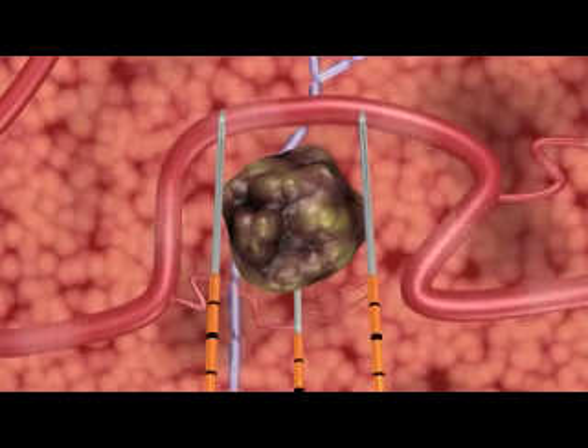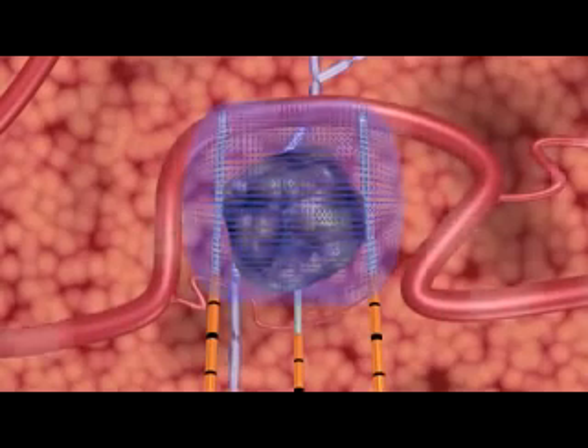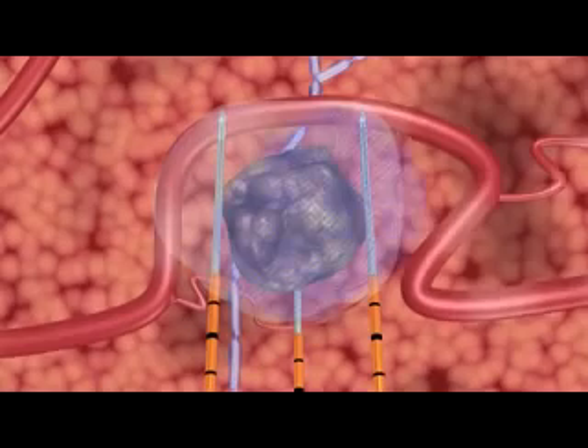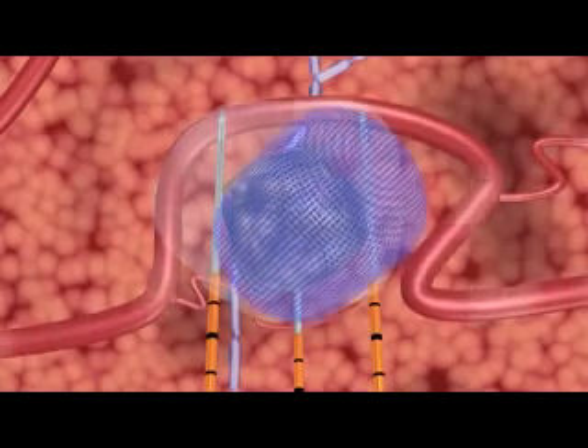The NanoKnife IRE system's unique action opens permanent nano-sized pores in the cell membrane, causing irreversible damage, which induces a cell death that mimics natural cell death.